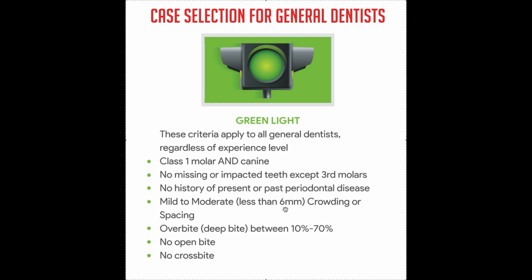That means it's not going to look that severe. These might be patients that have had ortho before and they relapsed. Or they could be teenagers, just very, very simple teenagers. It's probably not going to be adults that didn't have ortho before, okay?